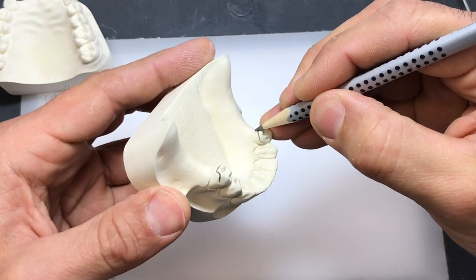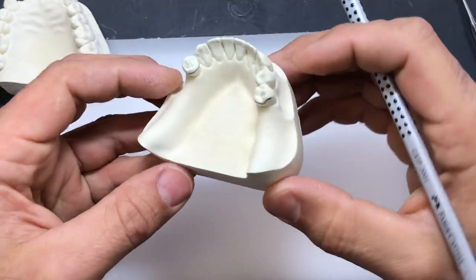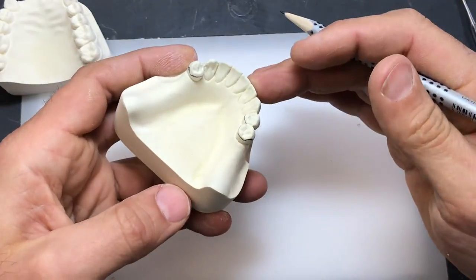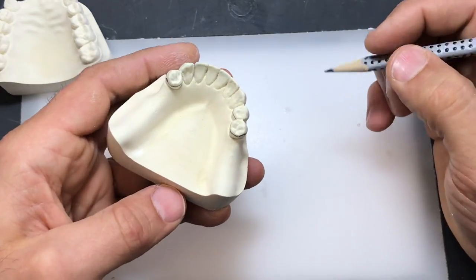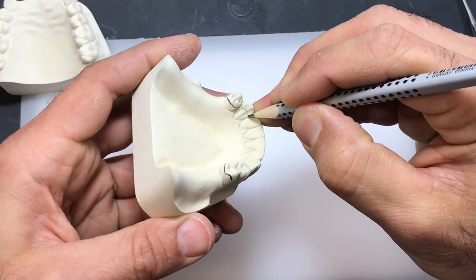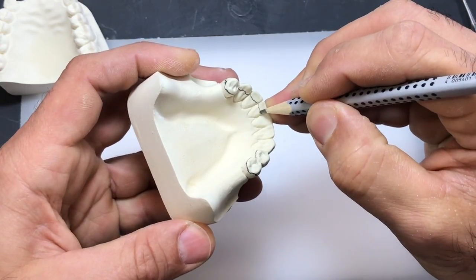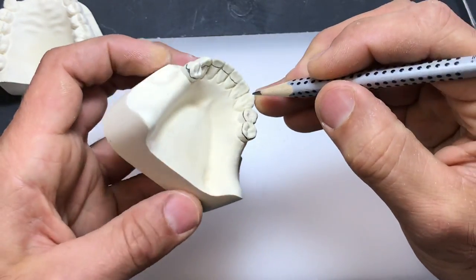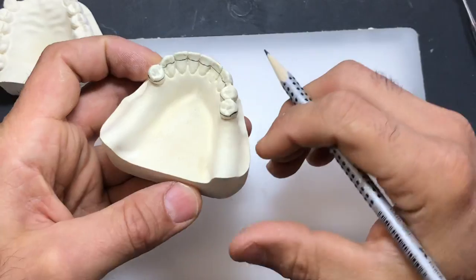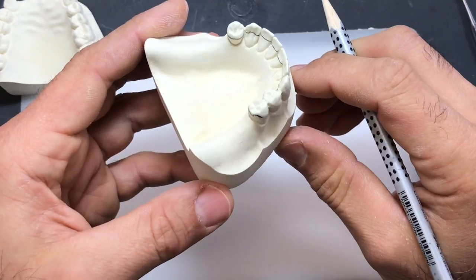You can tilt your model and adjust your pencil. I think if I were to put this model back on the surveyor, the survey line would be pretty close to where I have it now. Now we need to outline the rest of the base of this bite block. Just like before, we're going to go over the cingulum of the anterior teeth.